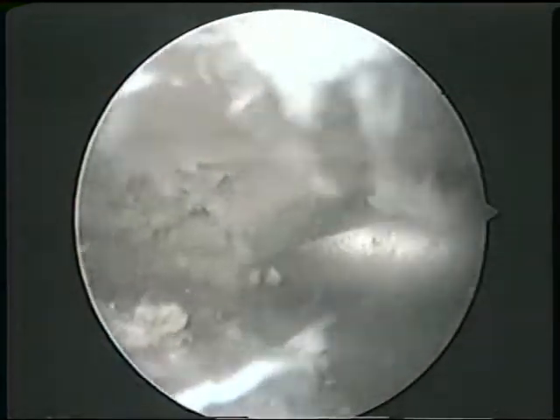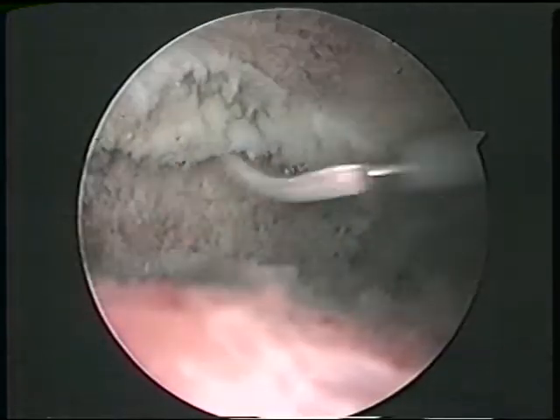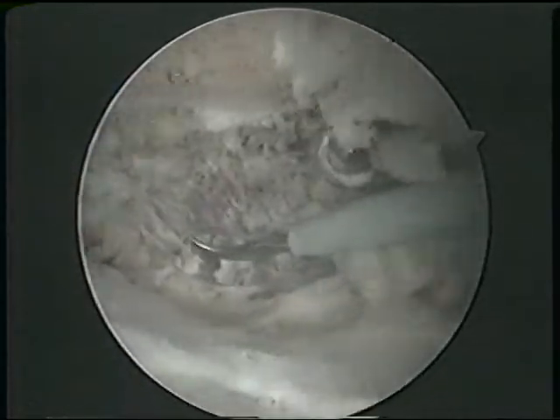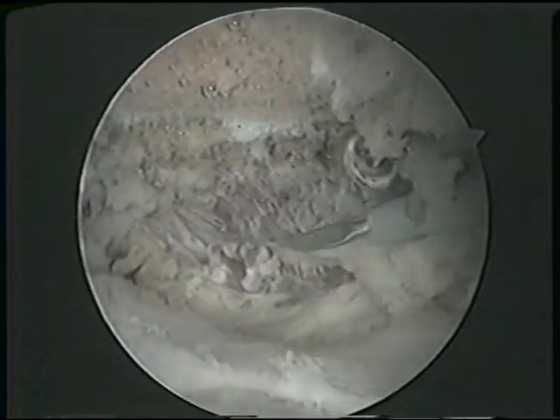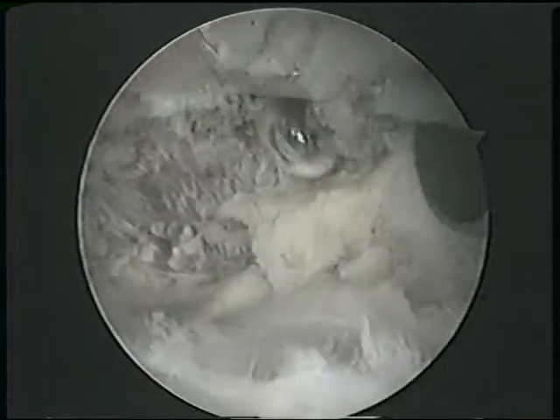At the end of the operation, the joint is washed out and a local anesthetic is injected to make you more comfortable. As the local anesthetic wears off, you will notice more aching in your shoulder. This usually occurs the following day. The incisions are closed with sterile strips and a sterile dressing is applied.